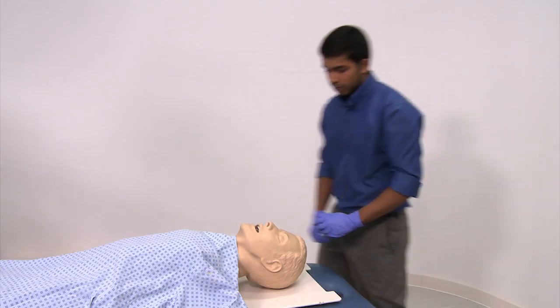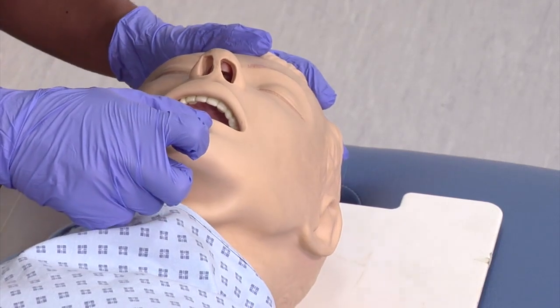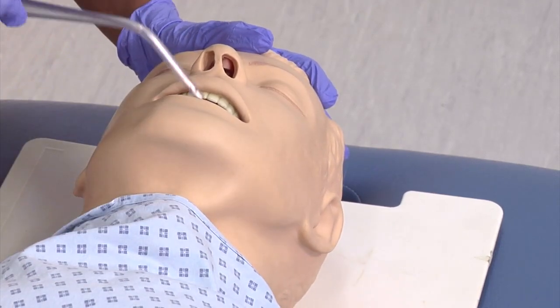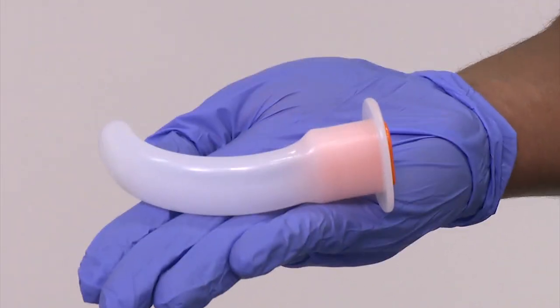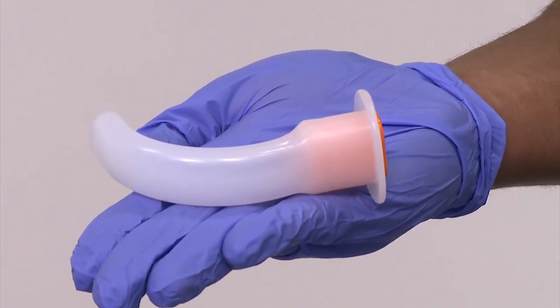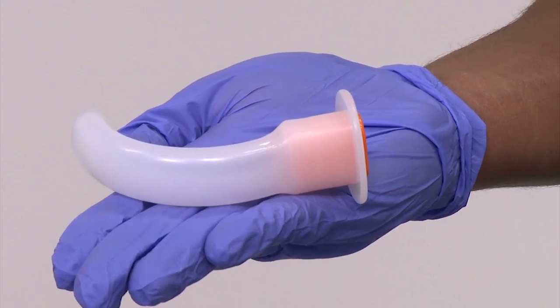First, open the mouth and inspect to assess whether an oropharyngeal airway is viable. The Guedel is a hollow tube with a tip at one end and a flange at the other. The body is semicircular in shape to follow the curvature of the palate.